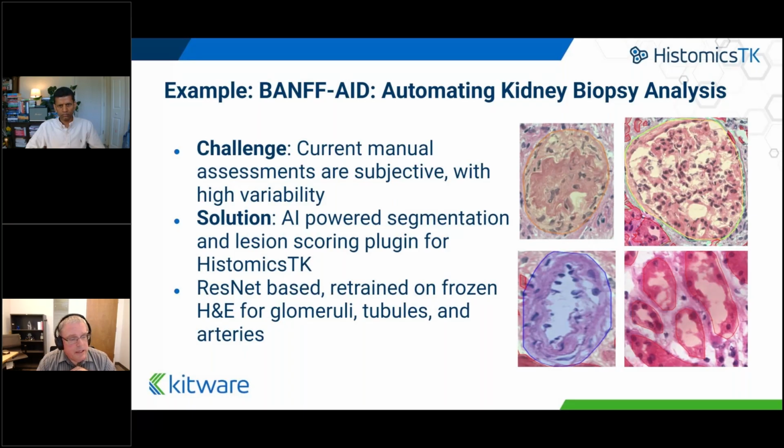And so part of this idea was that you could use AI segmentation, and then produce some sort of standards that you could get the experts to agree on. And if the experts could agree, then maybe you could have a trained system to do this. So there's a project where we're working on this.